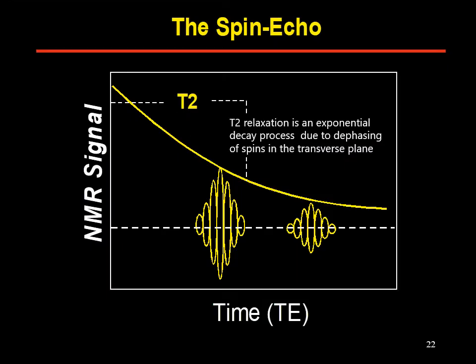With the spin echo pulse sequence, that inverting pulse can be applied multiple times, but with each echo, the total amount of signal is less than with the previous echo. If one joins the points at the origin with the peaks of the echoes using this experiment, the quantity that is obtained is called the T2 relaxation time.